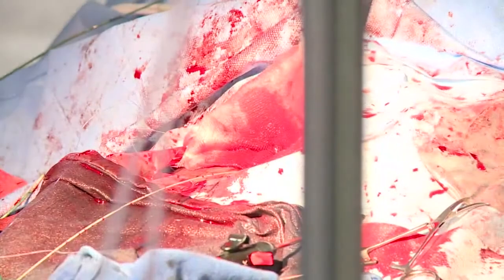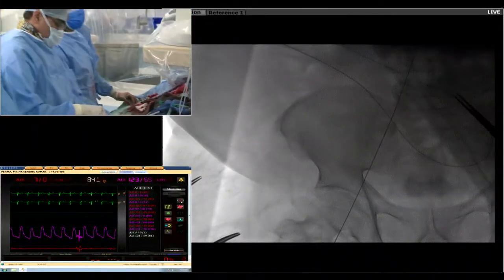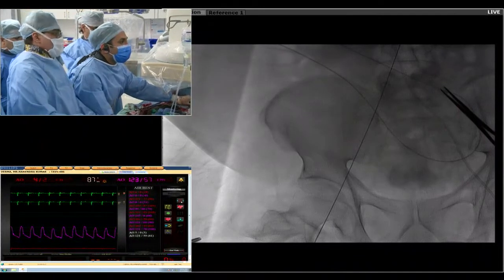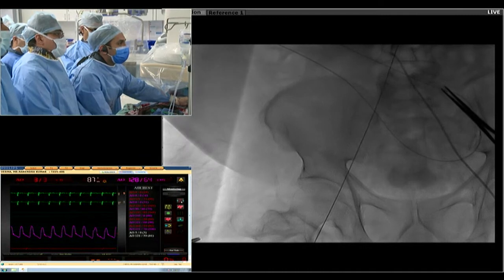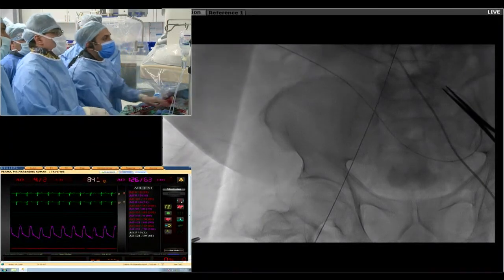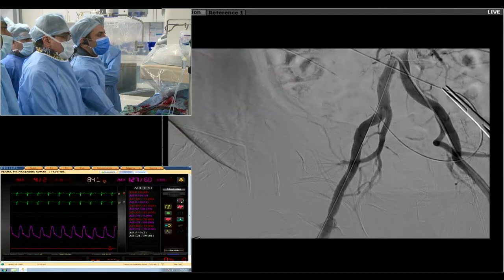Let's take a picture. Right groin 48 DSA. Let's take one picture, sir. Show me the JR there. So our pressure is still the same. That's important. We monitor. Inject. Okay, so let's take a DSA. Ready? Inject. Yeah, we are fine.